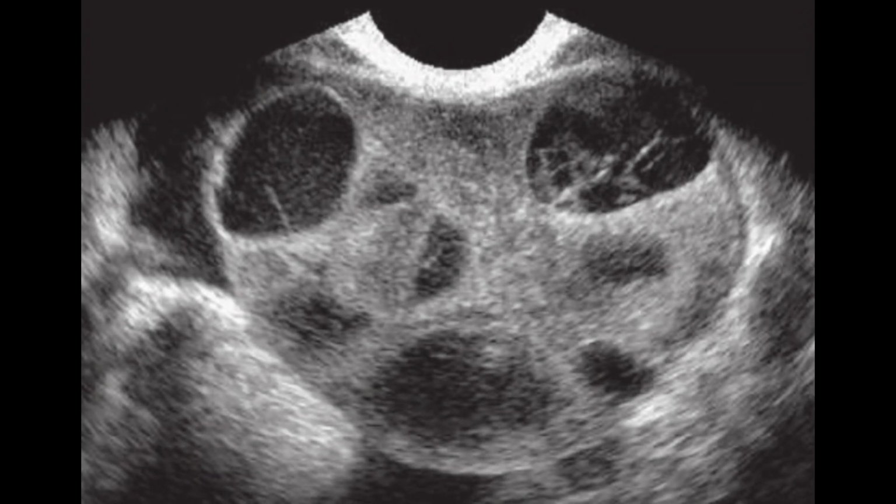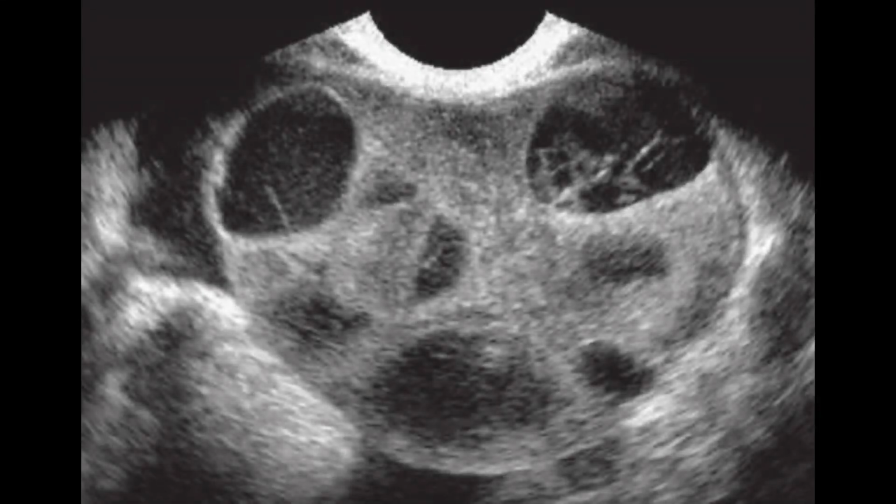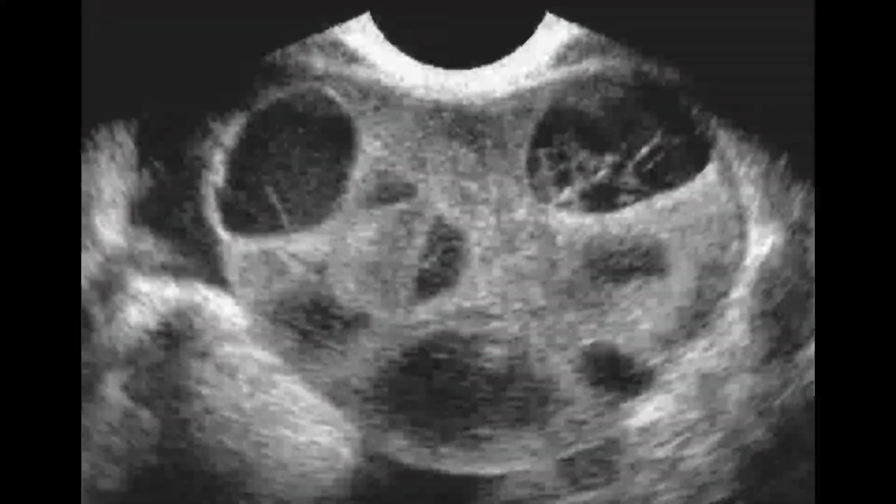Mild ovarian hyperstimulation syndrome would be considered when ovarian size is less than 5 centimeters. So that would be a mild degree. In moderate degree, the ovarian size would reach up to 12 centimeters, and that would be called moderate degree. And if the ovaries are enlarged, greater than 12 centimeters, that would be the severe form of ovarian hyperstimulation syndrome. As you can see on this slide, ovaries are enlarged, greater than 12 centimeters. So it's a severe form.